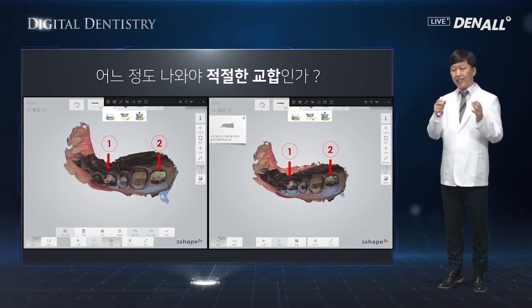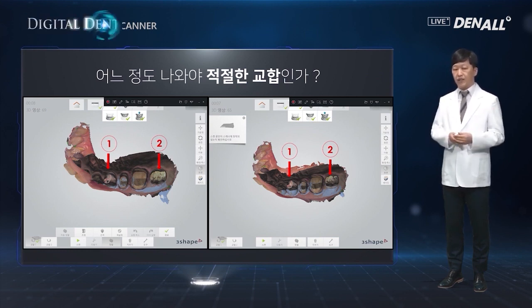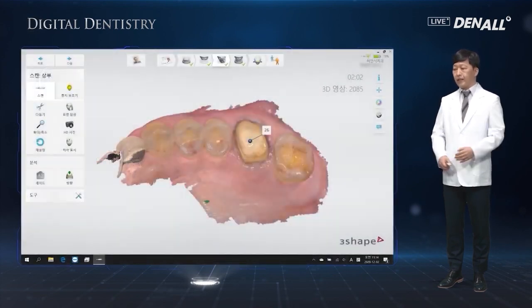So after scanning, after marking the occlusal points, we need to check whether the occlusion is accurate or not. If you neglect this process or step, it will take a lot of time for the occlusal adjustment, or you need to remake the prosthesis. It is very important to check the amount of teeth reduction and whether the prep is appropriate or not.